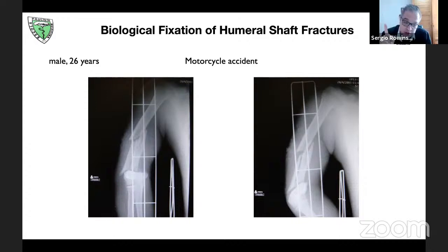I want to say 2 important things. First of all, the morphology of the fracture is not being fully comprehended in this image. We know that traction views help a lot, but it's very difficult. So in this sense, and I have experience in this point, a 3D CT of the whole bone would give us a lot of information. I have faced similar cases. This is one point. I would ask, and I have in 5 minutes in my public hospital, a 3D CT, which gives us a lot of information to know if I can do a bridge plate or not, because we are not having a good comprehension of the distal fragment.